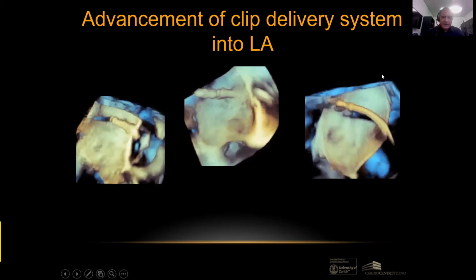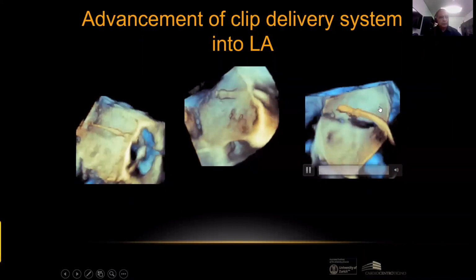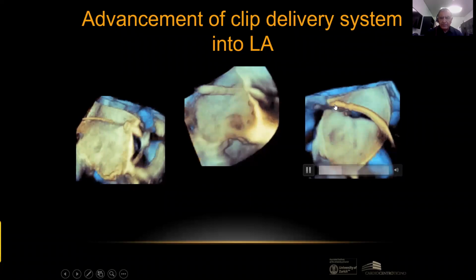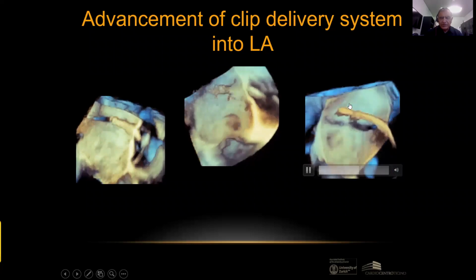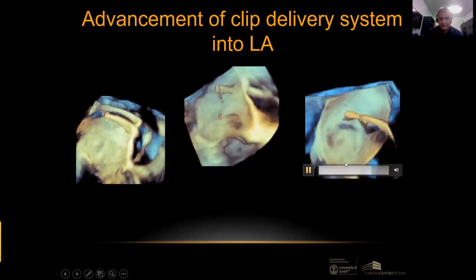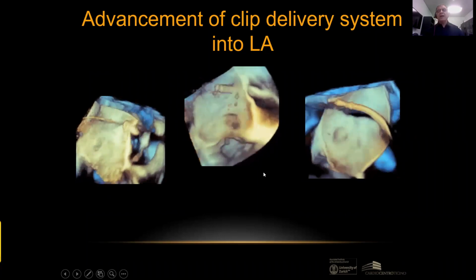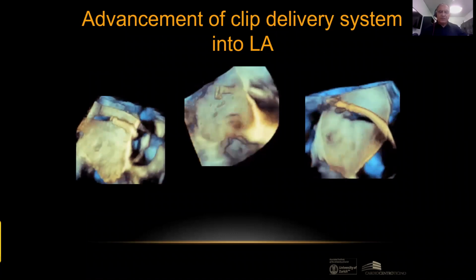Many times the catheter goes to the left atrium, and then when you push out the clip, it can be blocked by the atrial wall or by the ridge, and in these cases you have to go back. You have to go back, paying attention that this is the tip of the guide catheter, and not go back into the right atrium. But this can be very easily seen and very easily done with 3D echocardiography, as you can see here.